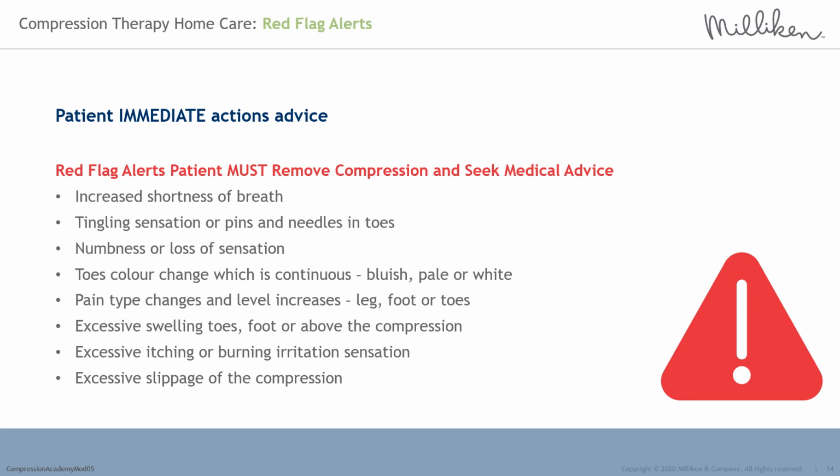Red flag alerts. Patient immediate actions advice. Red flag alerts the patient must be aware of. They are required to remove their compression immediately and seek immediate medical advice and assistance. They should be detailed in a patient information leaflet or document and have easy to follow procedures. Red flags include increased shortness of breath, tingling sensation or pins and needles in the toes, numbness or loss of sensation, toes colour change which is continuous. They may be bluish, pale or white.